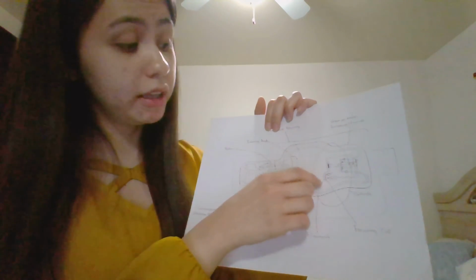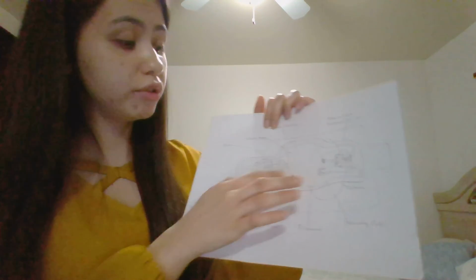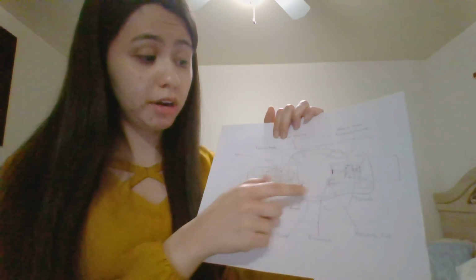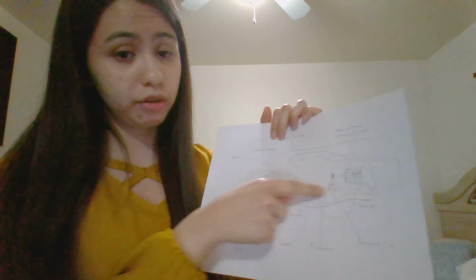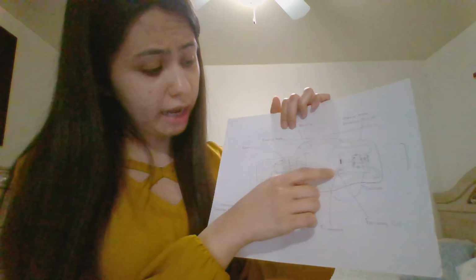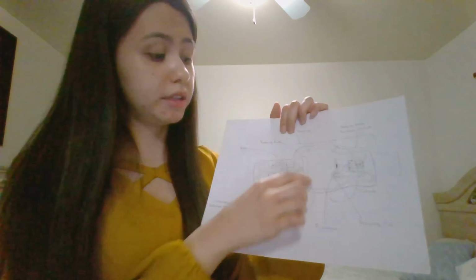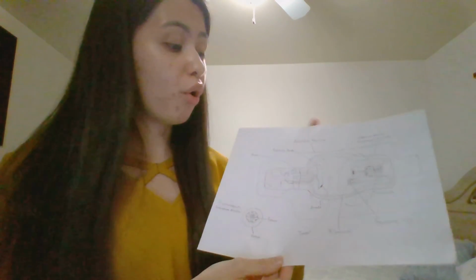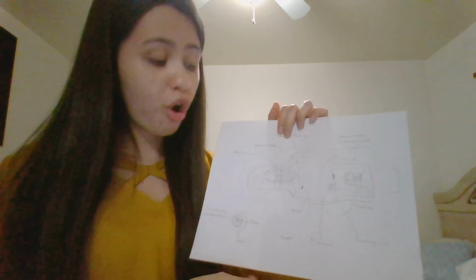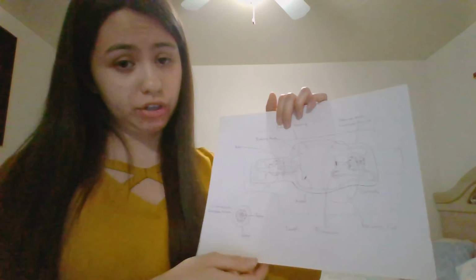So here we have a lot of electrons in the cloud just forming. They want to go to the anode. So as soon as we apply the voltage to the anode, all the electrons are going to go rushing over to the target, and that's called the tube current. And they could either have perfect interactions, go on through, make X-rays, make the photons, and go through the window and interact with our patient. Or they could have other interactions like characteristic or Bremsstrahlung interactions. Or most of the energy could just be lost as heat, and it'll go back into the X-ray circuitry.